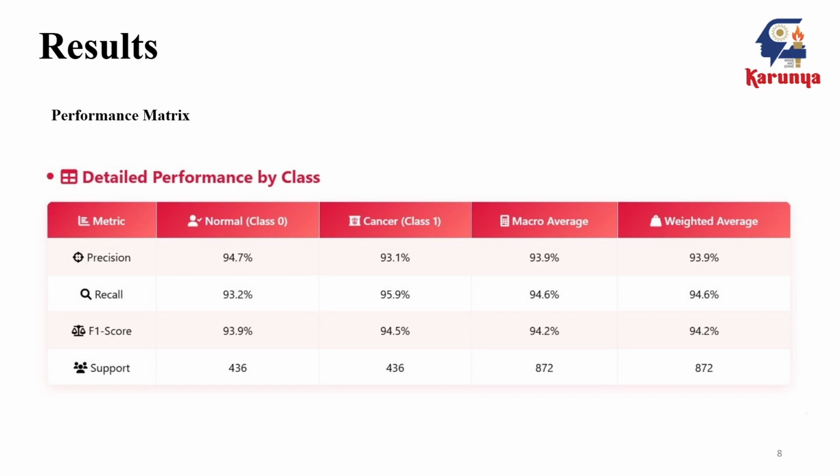To summarize, we have built a hybrid deep learning system combining EfficientNet B0 and DenseNet that detects bone tumor from plain X-ray images with 94.2% accuracy, deployed as a real-time web application accessible without any specialized hardware.